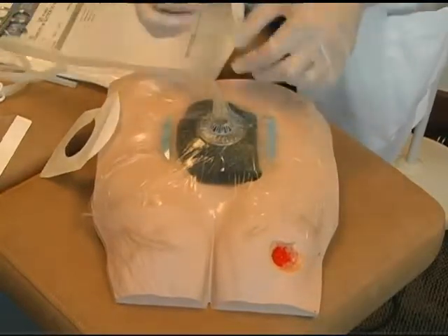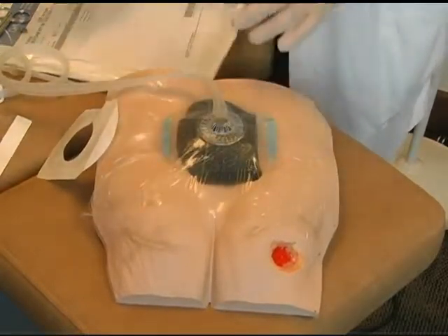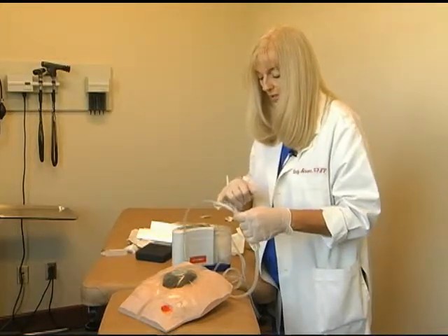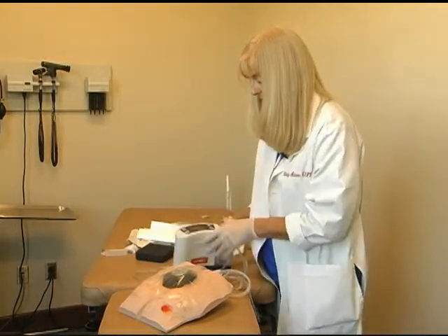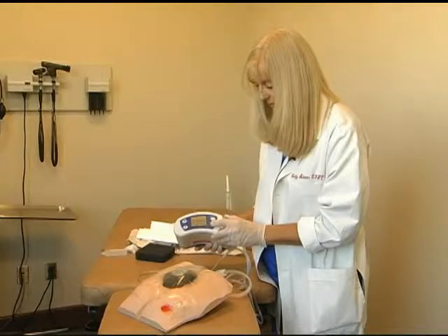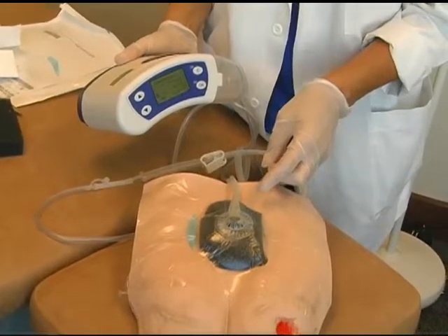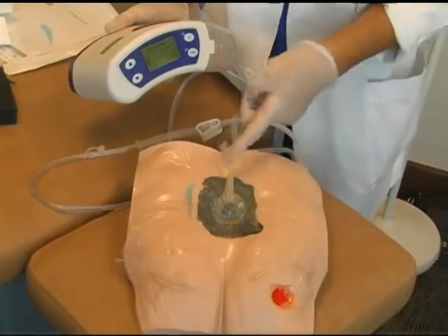Attach your dome connector to the tubing that goes to the pump. You may want to secure these junctions to prevent the patient from accidentally pulling them apart. You will begin to see the air evacuated from the dressing and notice the contraction or compaction of the foam going down within the wound margins.